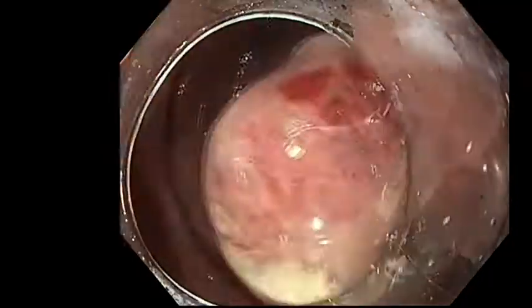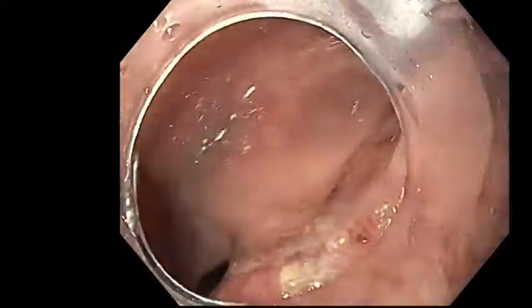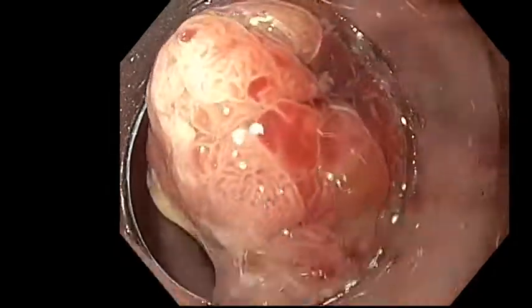The head of the polyp showed a tubular villous pattern. The stalk was thick, broad, and short, and part of its head had grown into the stalk. We used the attachment for better tip control.